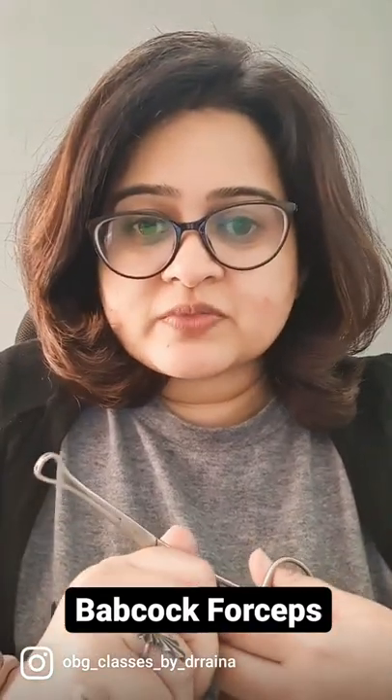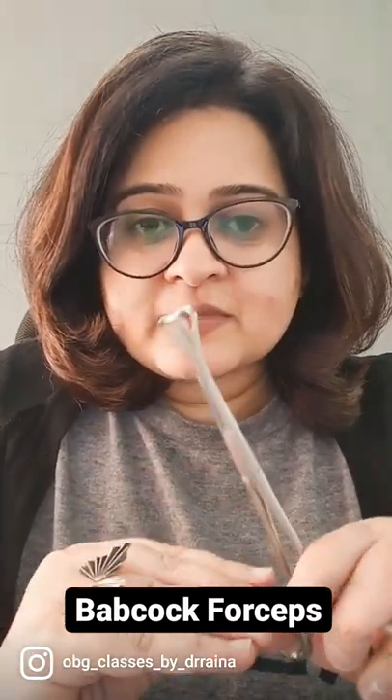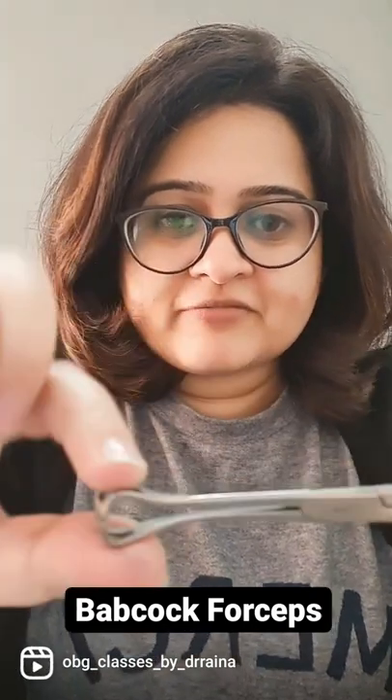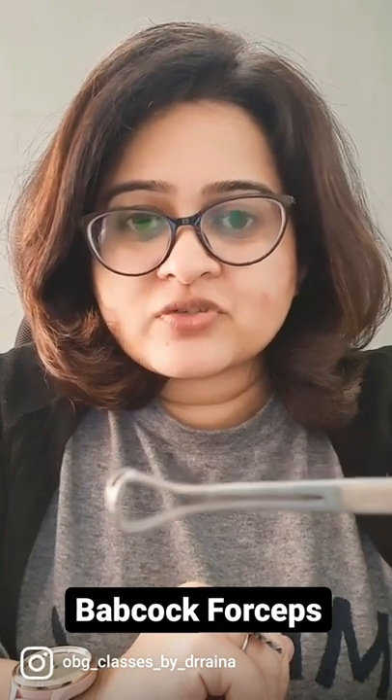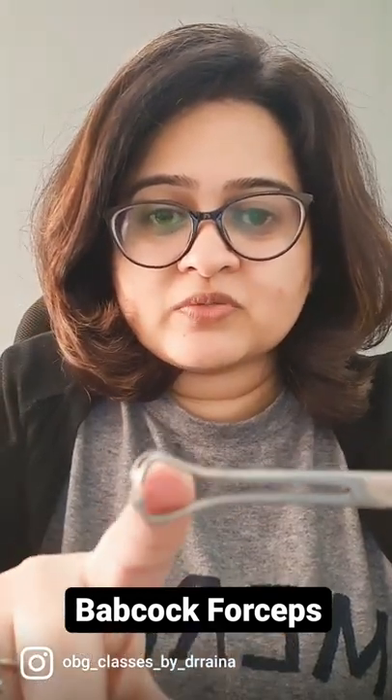The instrument we will discuss today is this instrument. This is a Babcock's forceps. Look at it carefully. See the end — there are no teeth, and it is an atraumatic instrument. There is a loop here to hold structures which are very delicate.